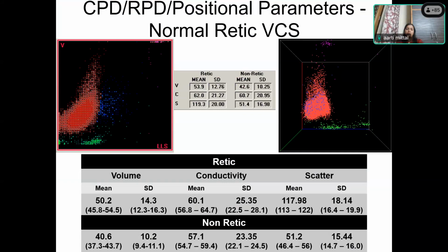Similarly, some cell counters will also do reticulocyte count based on the extra staining of the reticulum in the red cell. Therefore, it separates the reticulocytes from the red cells, and it also gives you the cell population data of the reticulocyte, basically the size of the reticulocyte and the conductivity of the reticulocyte. Simultaneously, it will also give you the size of the red cell, of course the MCV is there, so it will give you a lot of information on the red cells.